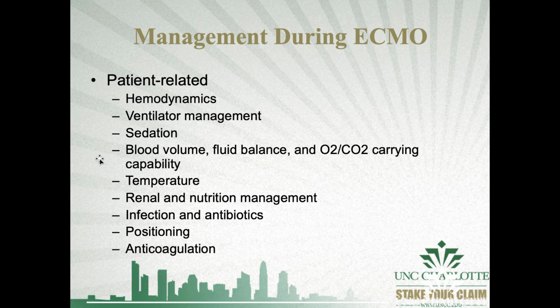Ventilator management is something that needs to be discussed, and it's research I've been pushing for years now. I really want to develop a study looking at the actual effects of quote-unquote rest settings, which there is no consensus on, and ECMO pump times, mainly with VV ECMO. So oftentimes the lungs are neglected with ventilator management. So I suggest that we maintain our normal ventilatory parameters in a safe range and assess for weaning and see if we can get them off the ventilator faster. And this is especially true for VV ECMO.